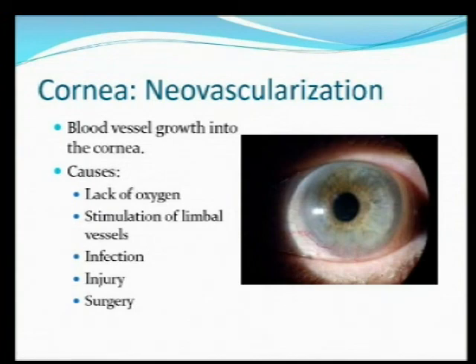Now, it's not uncommon with a new contact lens patient to see a little engorgement in the limbal vessels. And usually that's okay. What you're concerned about is when the vessels start to invade and they start to divide. You see that, you've got a serious problem, and you need to refit with something that's going to get a lot more oxygen to that eye. And if it's an existing wearer that comes in and they've got vessels that are in more than 1 millimeter or so, I would consider taking them out of contact lenses.